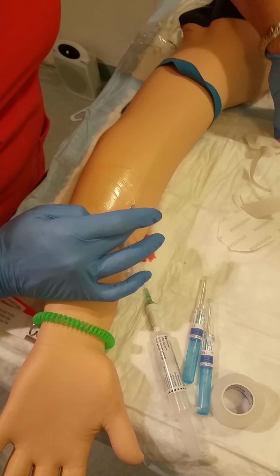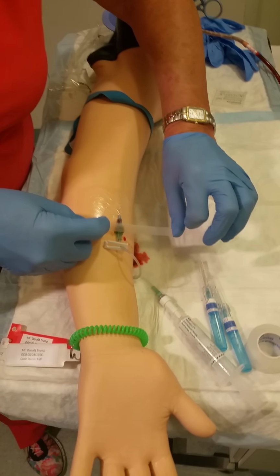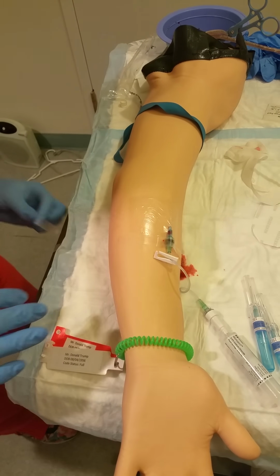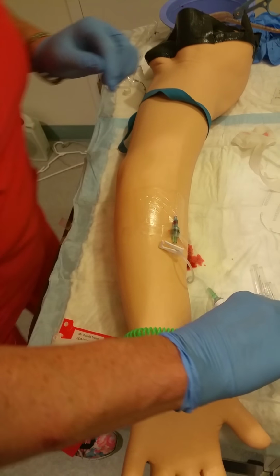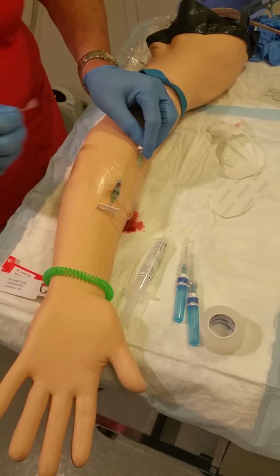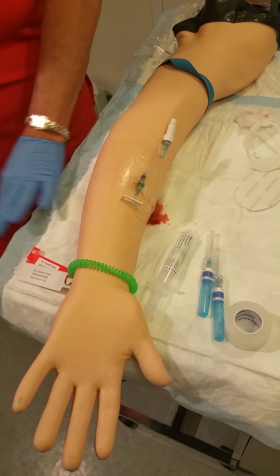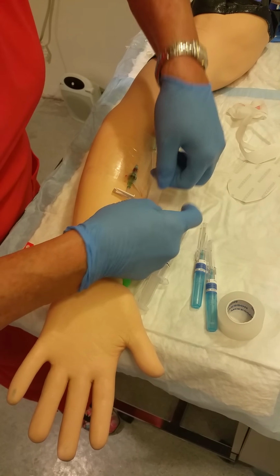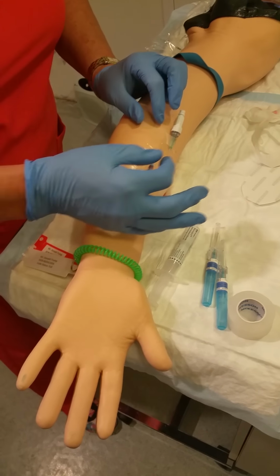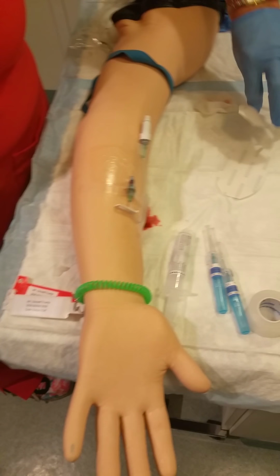make it look pretty. Take one piece of my tape and secure the extension set. That's pretty long, I don't need all that. At this time I can remove my flush, and I'll tape the extension set down to secure it comfortably for my patient. I don't like to really tape much over the tegaderm because we have that clear dressing so that we are able to visualize our site.